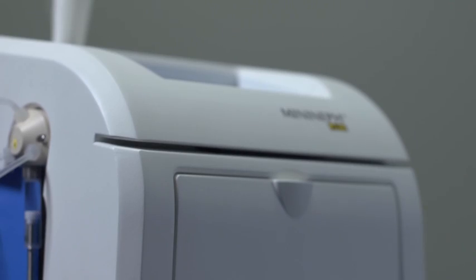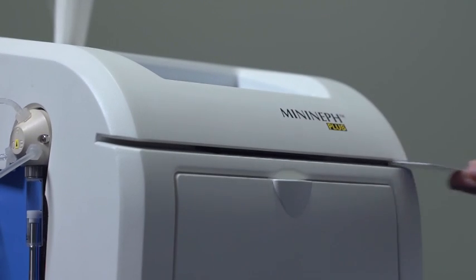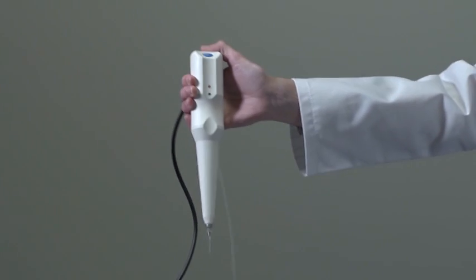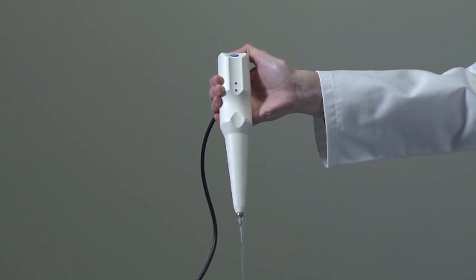A magnetic swipe card is pre-programmed with the assay specific data, including the calibration curve, which will reduce costs. A unique feature of the MiniNef Plus is the integrated pipette, which aspirates pre-programmed volumes using a single button, saving time when running an assay.